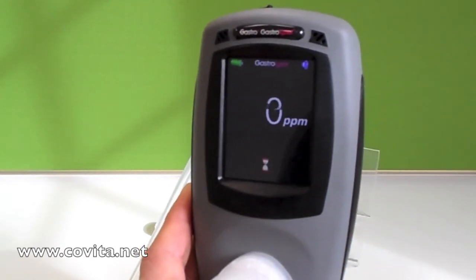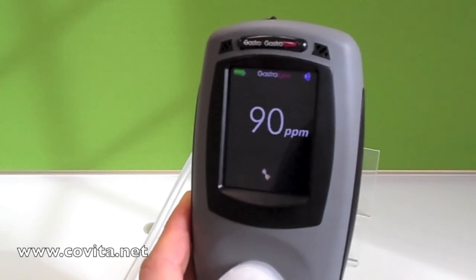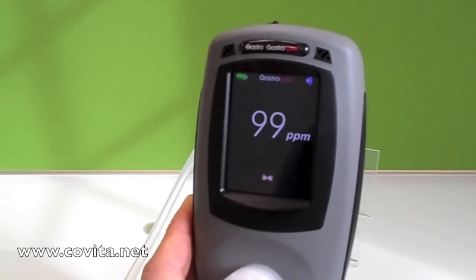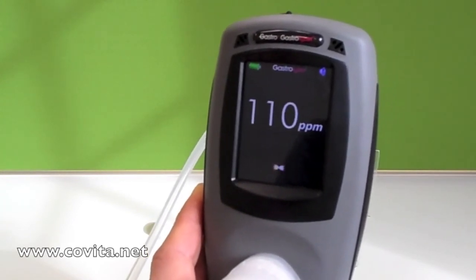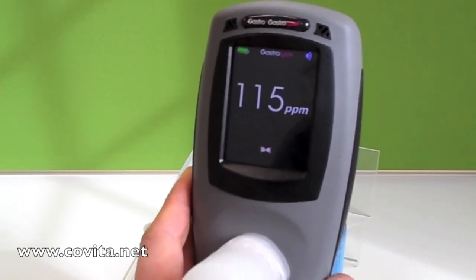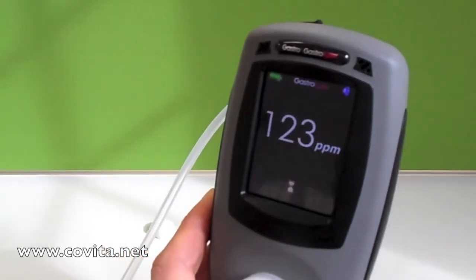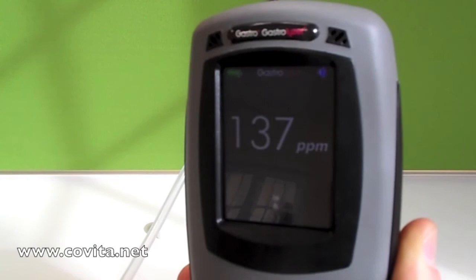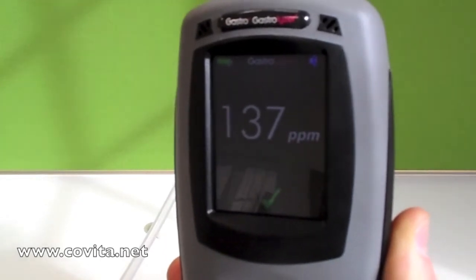Next, you will see a spinning hourglass as well as a PPM level. During this time, ensure that there are no kinks in the calibration tubing. You will want to let the monitor count up until you receive a check mark.